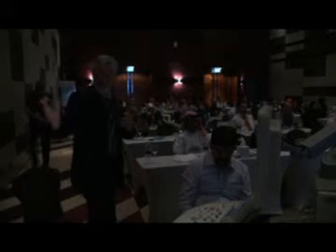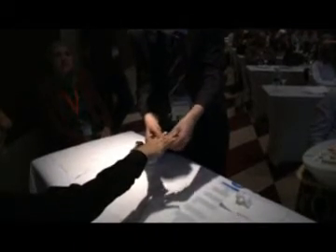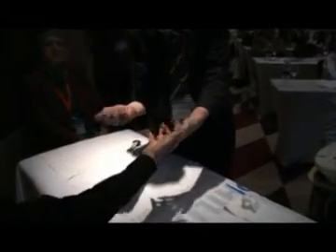Arthropathies, and then we will have another patient for 10 minutes. And when I first saw you, I thought, okay, that's straightforward, rheumatoid arthritis, just show you some typical erosions. But it's much more interesting because it's not so easy. So he's a 50-year-old man. On examining, you really have difficulty if you flex it.